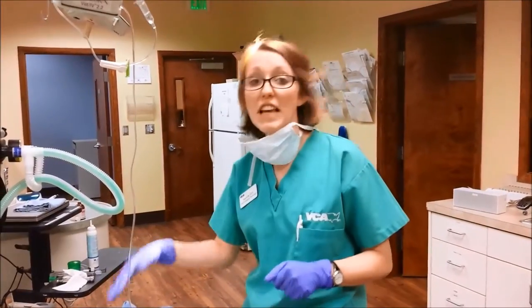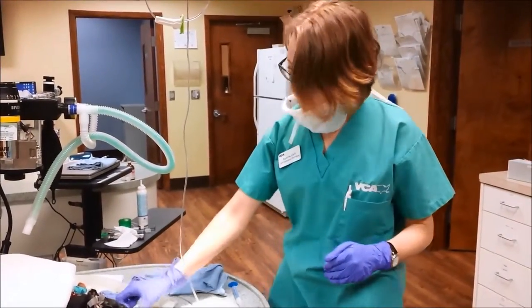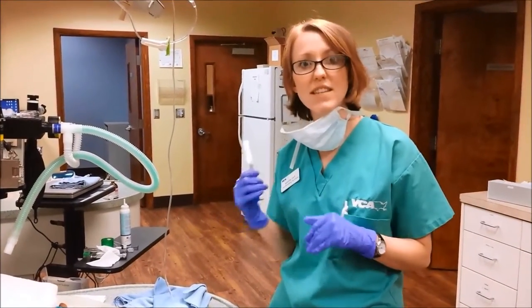We just finished with our dental cleaning. I've applied the fluoride, and we're going to let that sit for a couple minutes. While she's still under anesthesia, we're going to go ahead and microchip her so that she's safe.